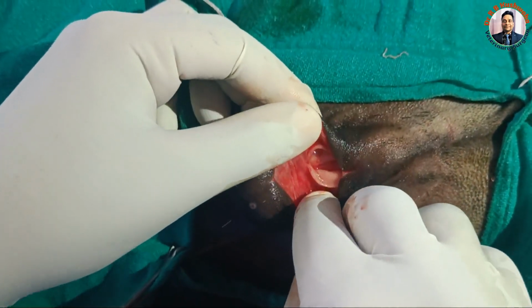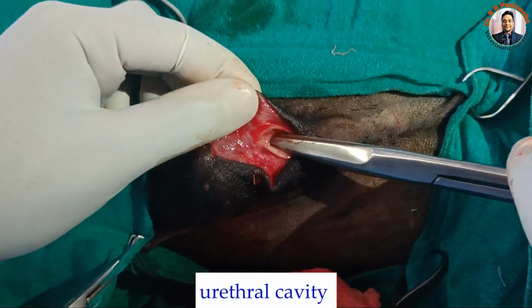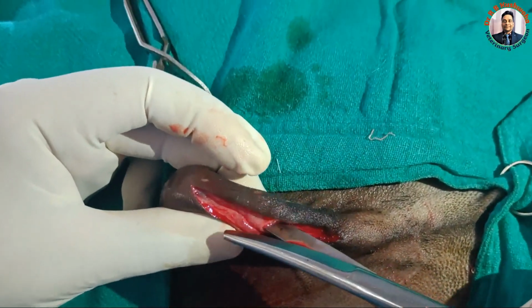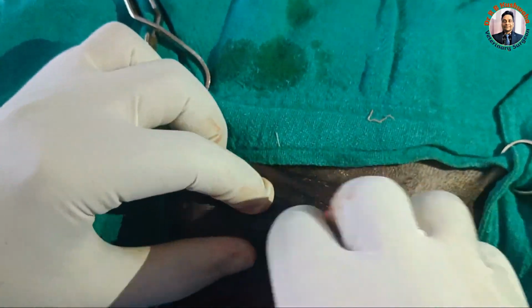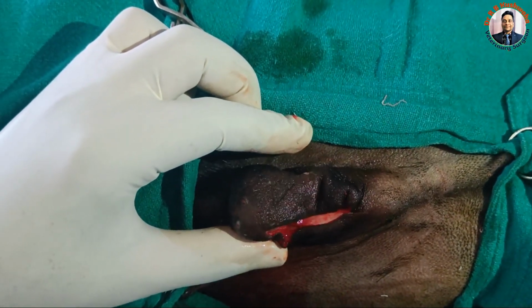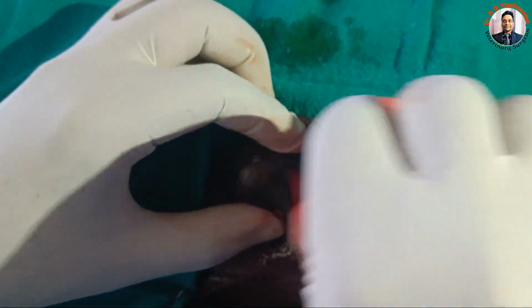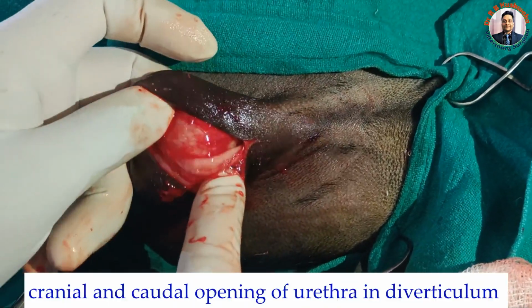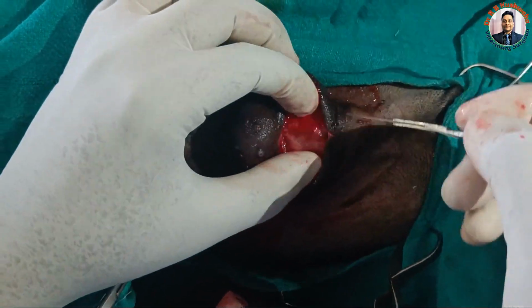So this one is the cavity. Give the forceps, thumb forceps. So now we identify this opening. We have to increase the incision accordingly.